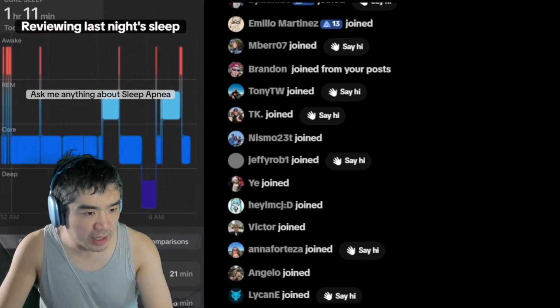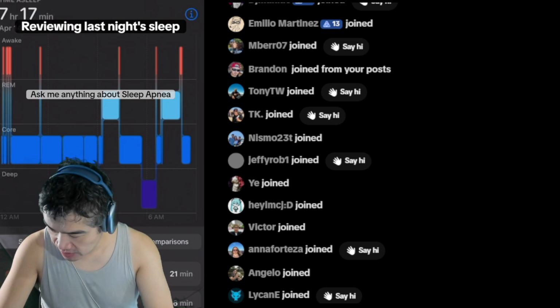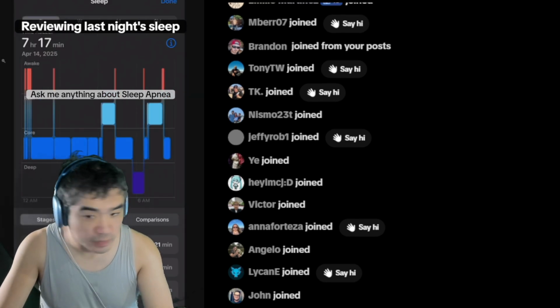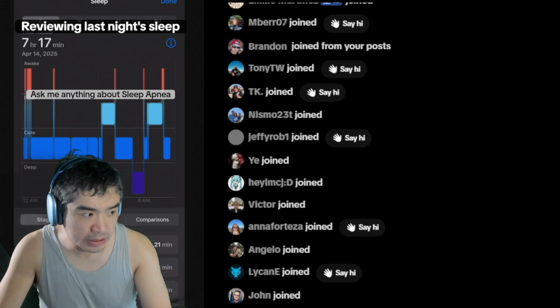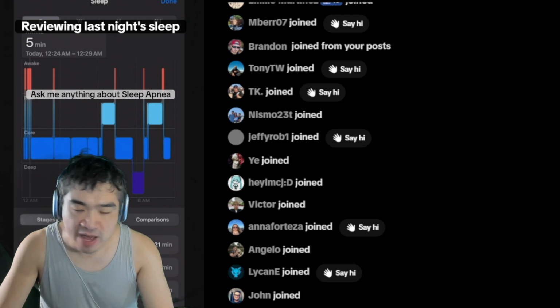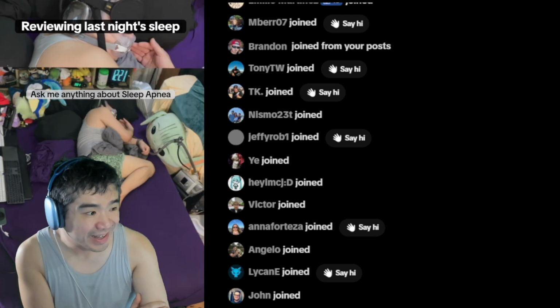Now, whenever I tally up my sleep for the night, it says 7 hours 17 minutes. Ooh, I cannot get that frame. 7 hours 17 minutes. I usually round up to the next half hour because I usually find there's 5 minutes of wake time here that I kind of debunked. Another 5 minutes coming up at 12:24. Yeah, we'll look at that again.